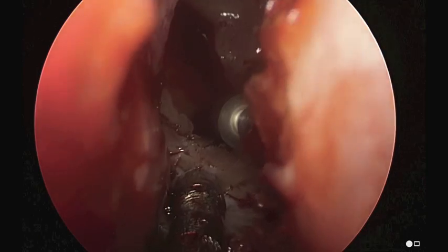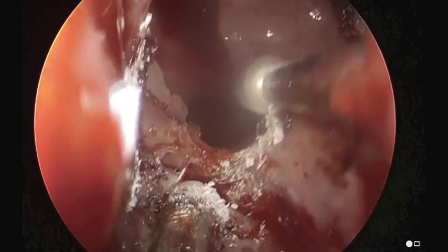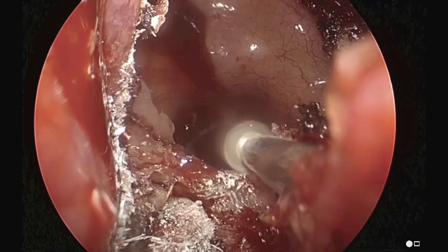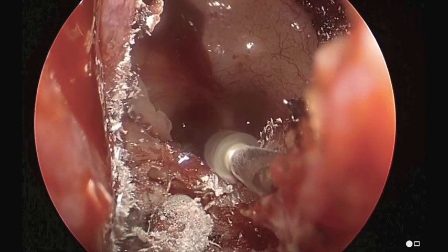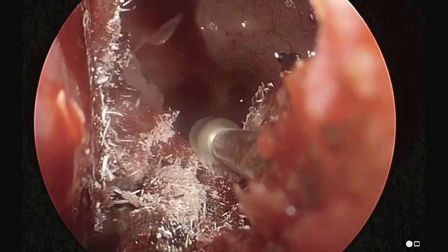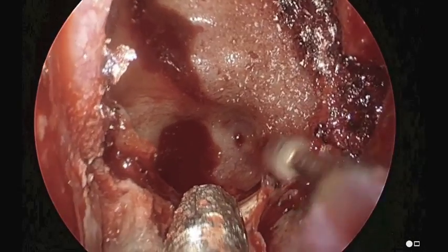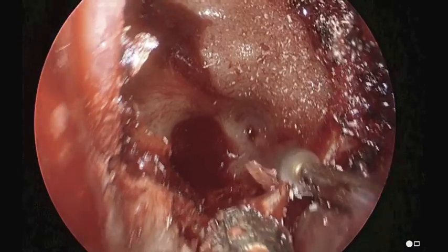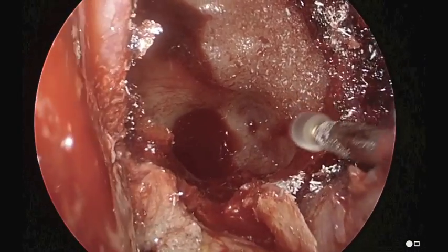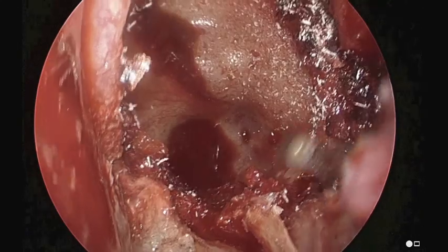The approach is done through a transnasal transsphenoidal endoscopic approach. This is an extended approach for a pituitary where we have to drill more inferiorly to expose the clival region where the entrance and drainage point of the petrous apex is.